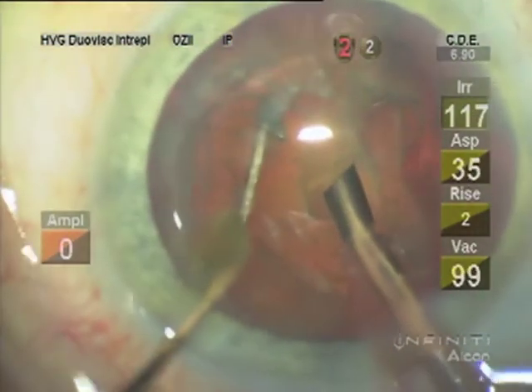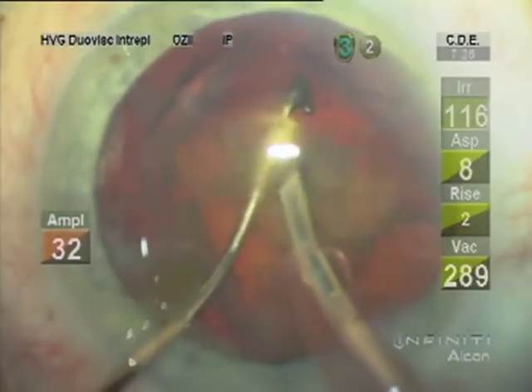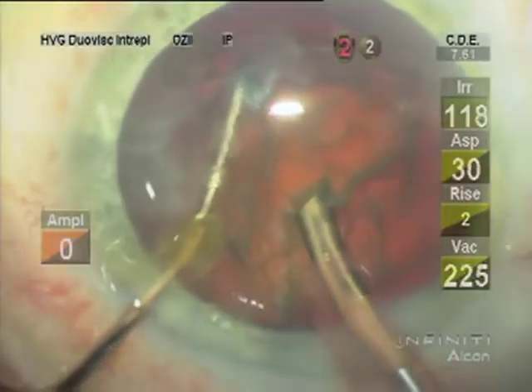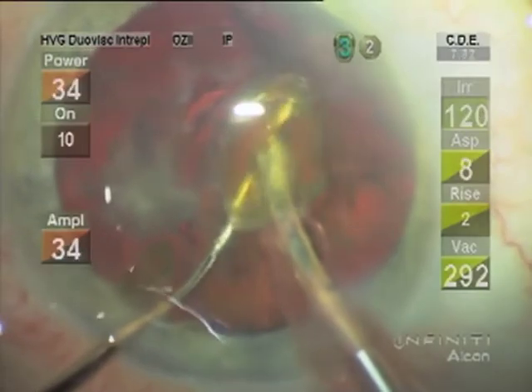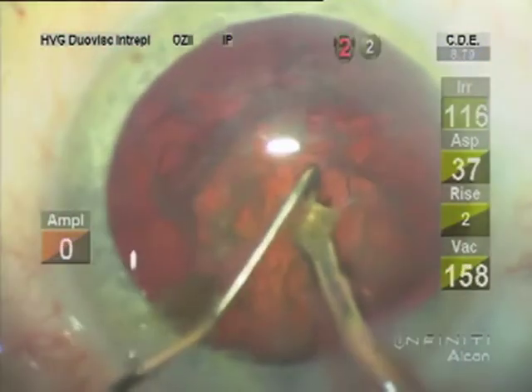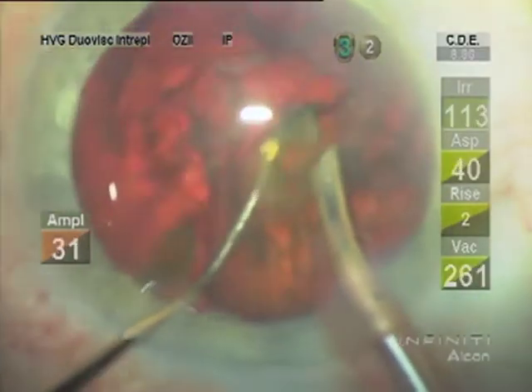Notice the vacuum doesn't always go up to the maximum, particularly during phaco. You can see me starting to protect the posterior capsule with the second instrument as we're fracturing the second hemisection, because the posterior capsule is not as well supported. After I have fractured and turned to position three again, I always make sure that second instrument is under the tip to guard against any chamber collapse and posterior capsule rupture.